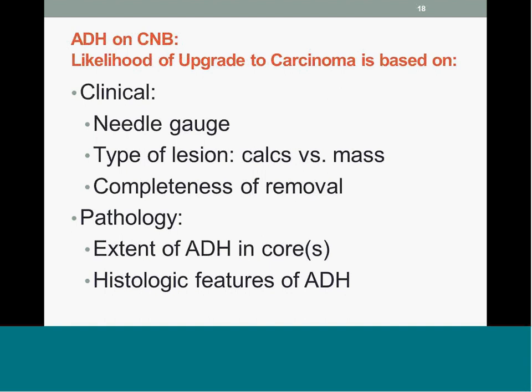On the clinical side, as we talked about, the size of the needle core is important. Whether or not it's a calcification that presented as the lesion of interest, or a mass, is important. The reason being, if it's a mass, then it's more likely to be upgraded to a carcinoma than if there are calcifications, which may or may not have been completely removed by the core biopsy process.